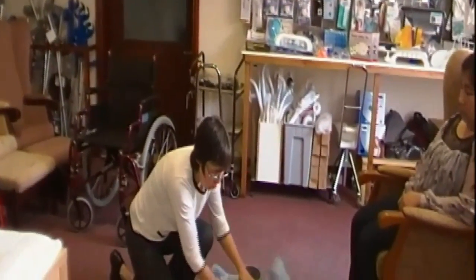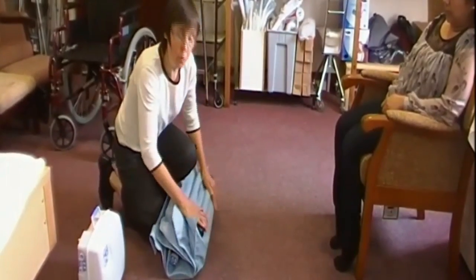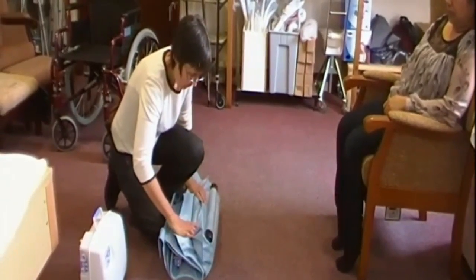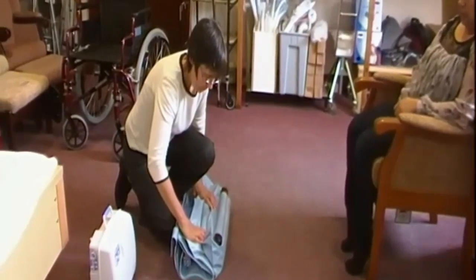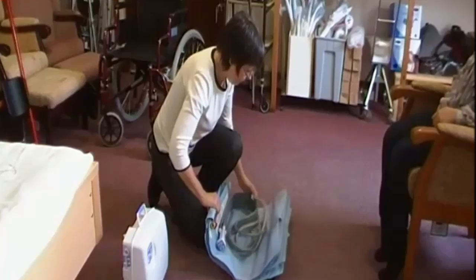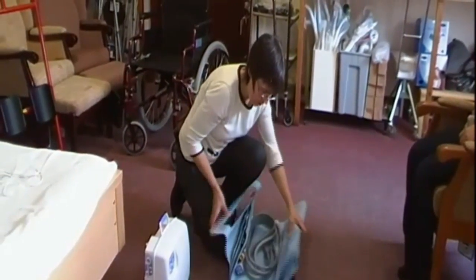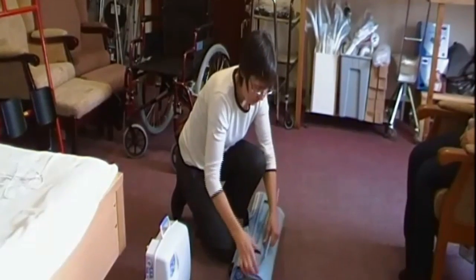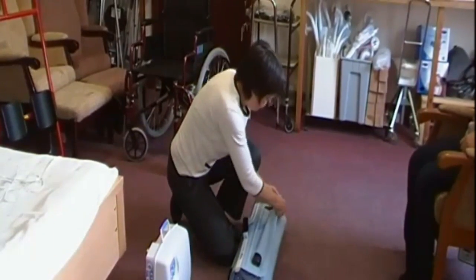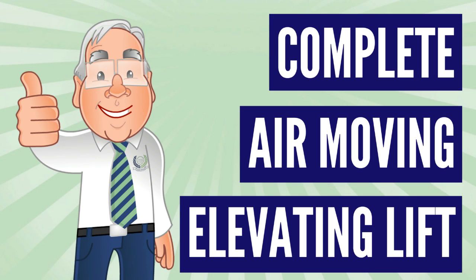And this all winds back up. You find that the ambulance people often arrive with one of these. You need to get the air out. Wrap those up in it, and then they're available for the next time you need to use it. Ready to go.